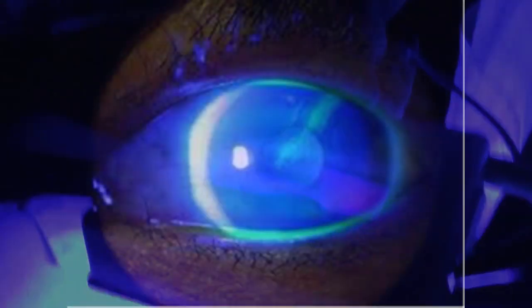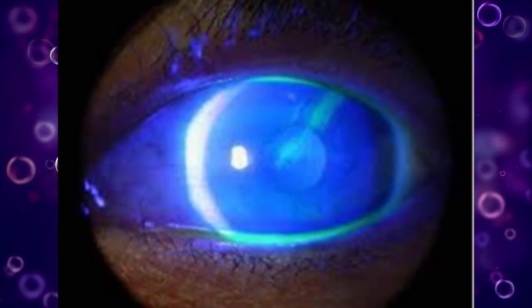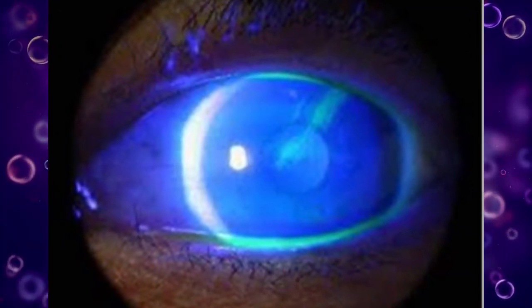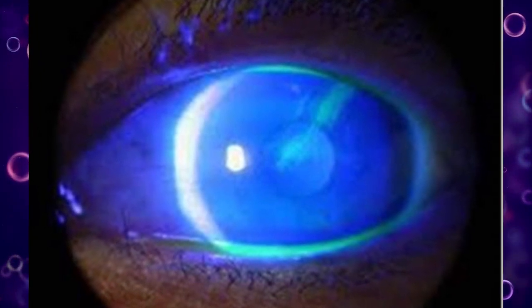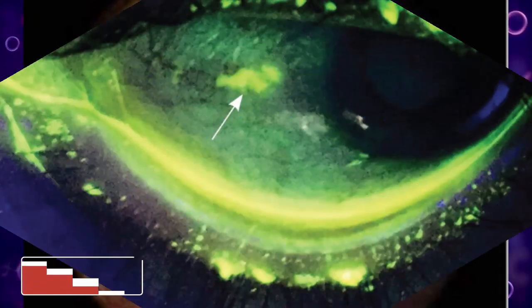This procedure can also be used to determine if you have a corneal abrasion on the surface of your eye.